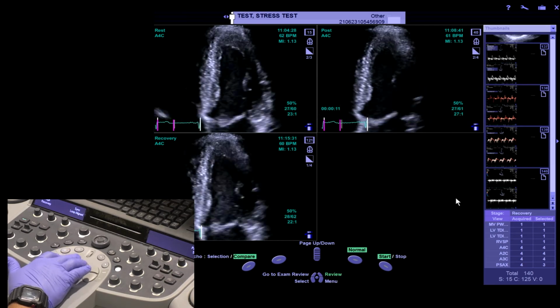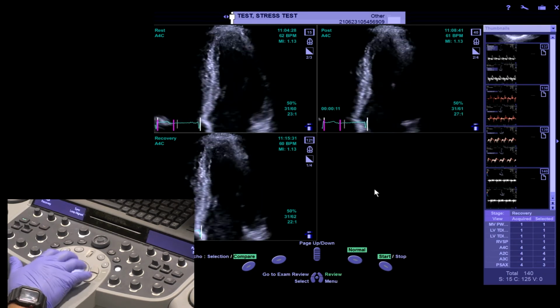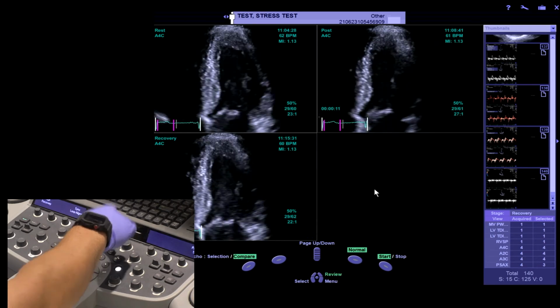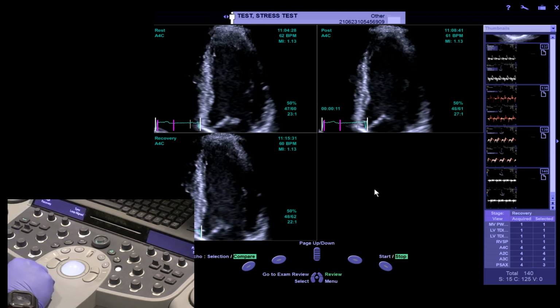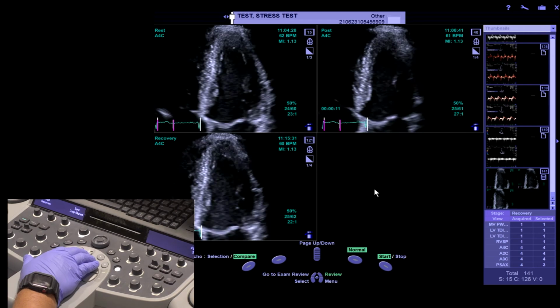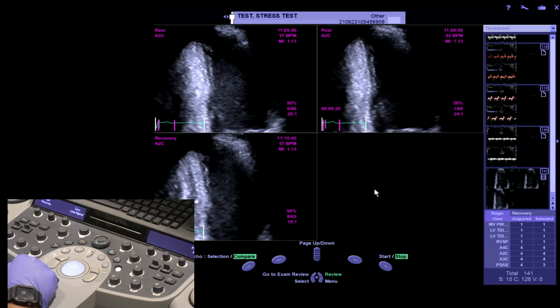Once you've done that, again, a workaround for a Syngo Dynamics problem is to acquire the review image as a live acquisition. So that way, again, it makes it a single image showing all 3 stages for your physicians to easily review. And I would encourage you to do that for each individual view.